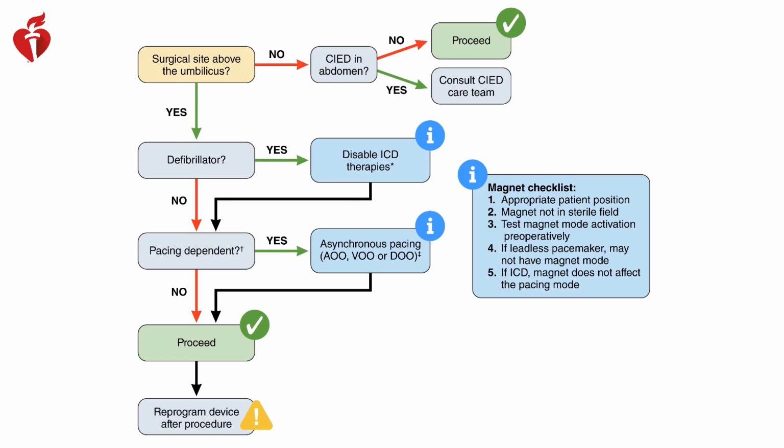First of all, if the surgical site and the electrical return pad are below the lower half of the body, the chance of electromagnetic interference is actually quite low. And as long as the device is not in the abdomen, you can proceed with the surgical procedure without a high risk of interference. Next, we decide, is the device a defibrillator or is it not?